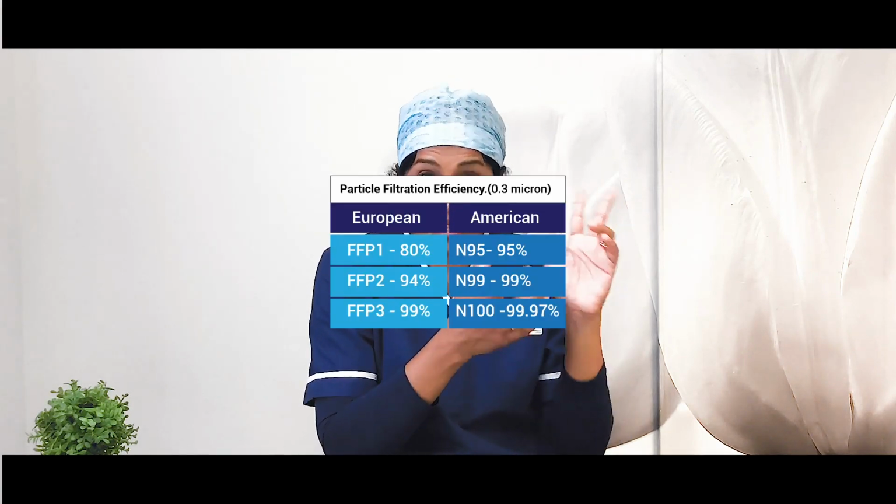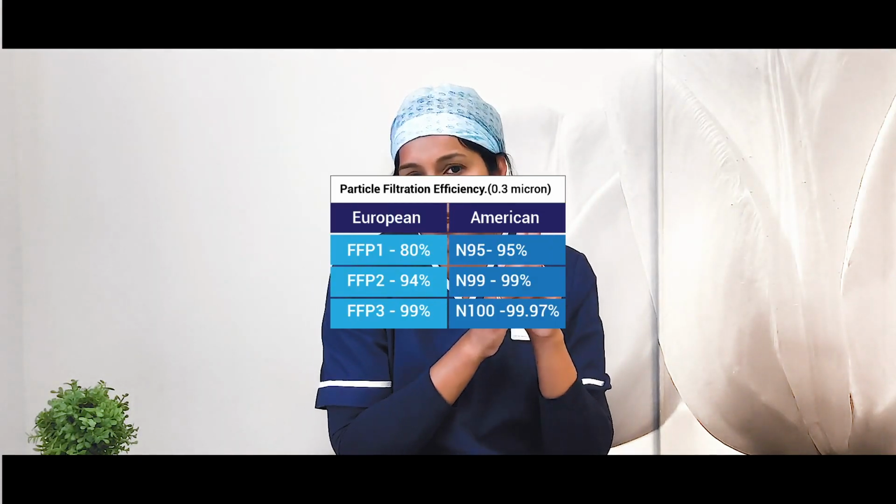With surgical masks, as I explained to you, the most important thing we check is the bacterial filtration and the breathability. We do check the particle filtration, but it's not done very well and it is not very efficient. And then obviously flammability and fluid resistance. These are similar things that we check in a respirator, but in a respirator, the FFP. So there are two different standards.